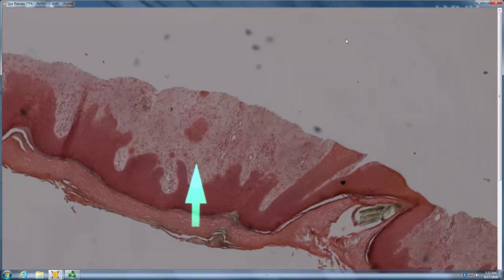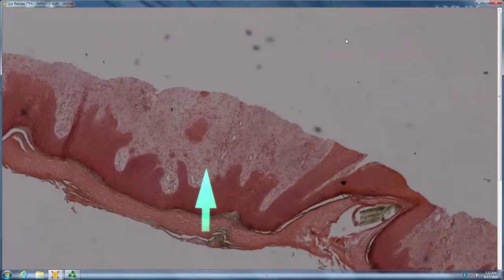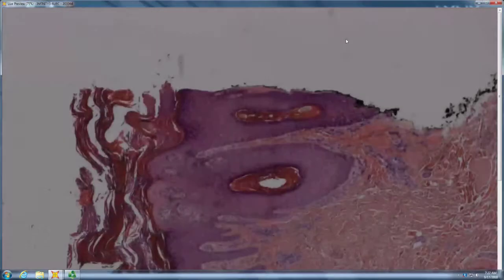And you have angiofibroplasia of papillodermis. So you can see either vertical streaking of collagen in the papillodermis or just sort of fibrosing granulation tissue, which they call angiofibroplasia. So there's a lot of vessel, a lot of fibro going on in the papillodermis. And those are LSC prurigo type features. What's the difference? If it's a bump, it's prurigo. If it's a plaque, it's LSC. That's about it.